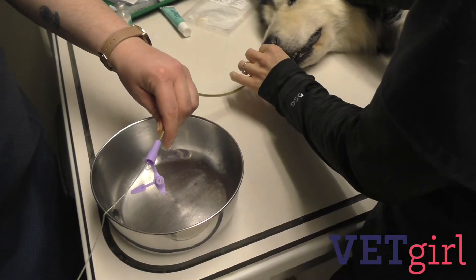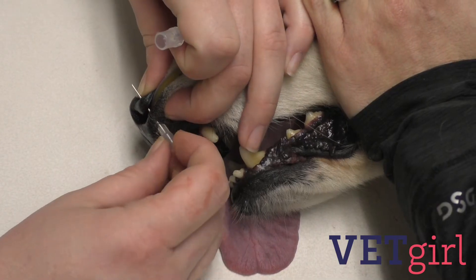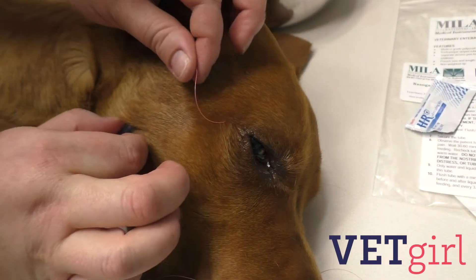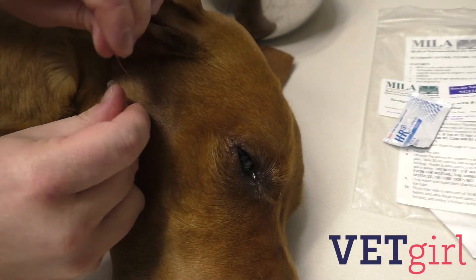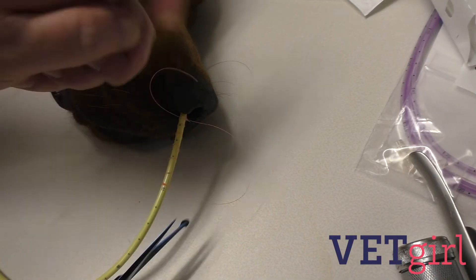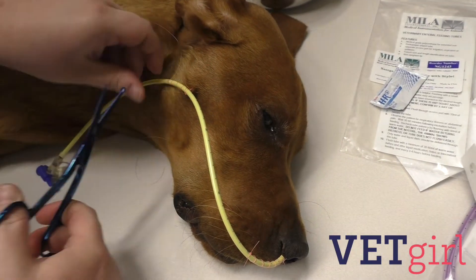Once the tube is confirmed to be in an appropriate location, secure the tube with a finger trap suture pattern starting with stay sutures through the lateral nares. Another stay suture should be placed to secure the tube near the zygomatic arch. Avoid securing the tube too tightly adhered to the face as it can lead to skin irritation or pressure sores. Also, try to minimize the tube or suture contact with the sensitive whiskers.